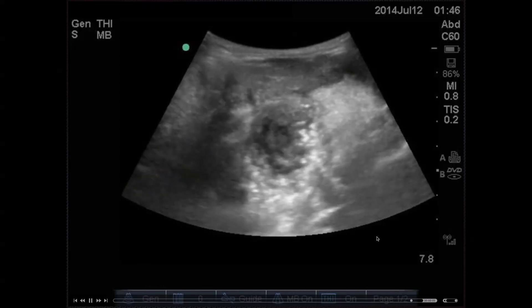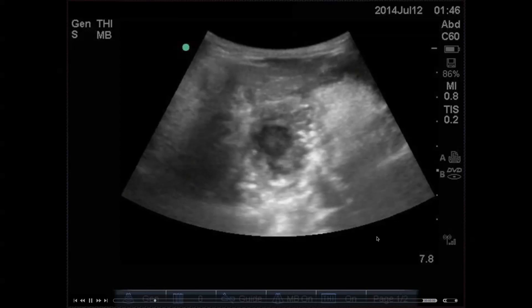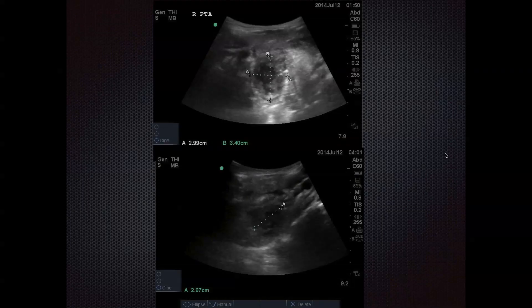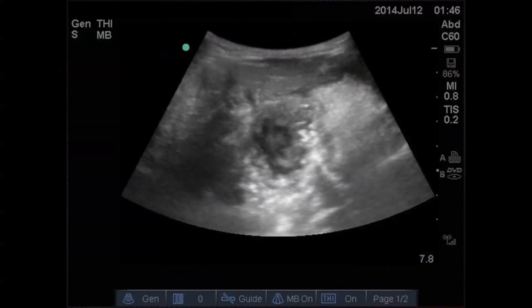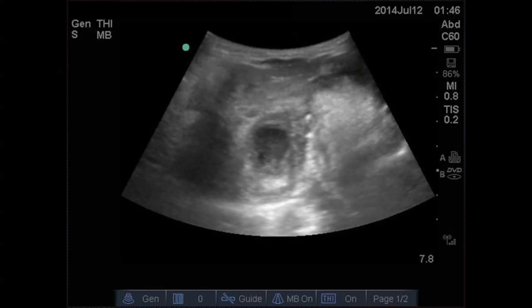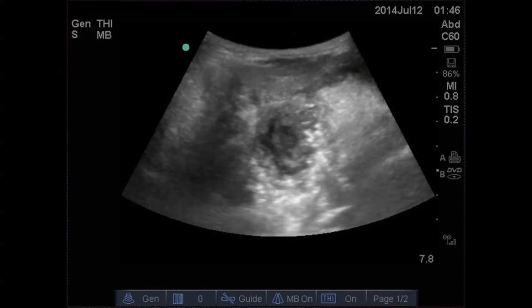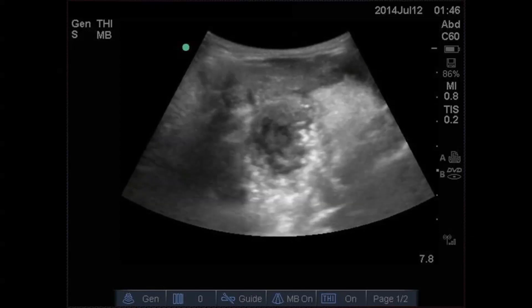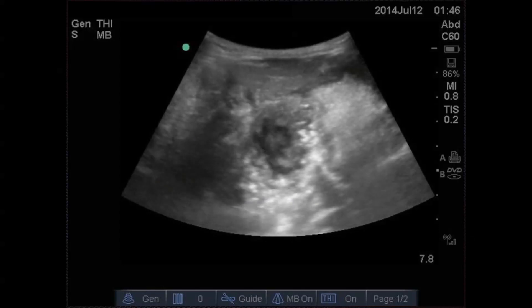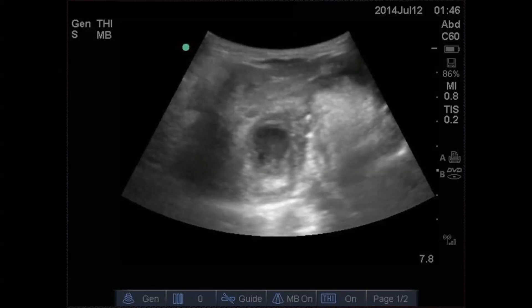We canceled the CAT scan right away, saved some radiation, and were able to measure it. You can see the measurements are about three by three and a half by three centimeters. We knew right there what the size was and that he definitely had a peritonsillar abscess. This is the submandibular approach.